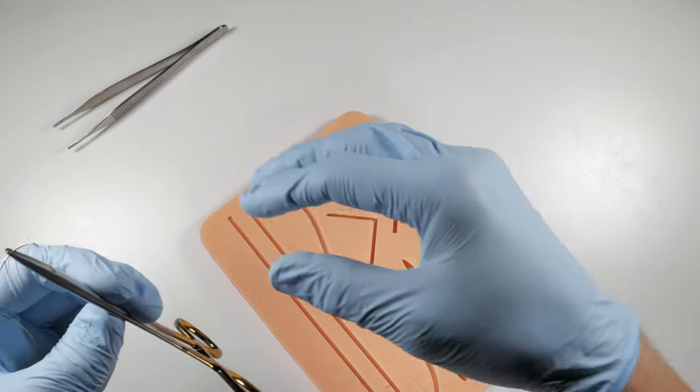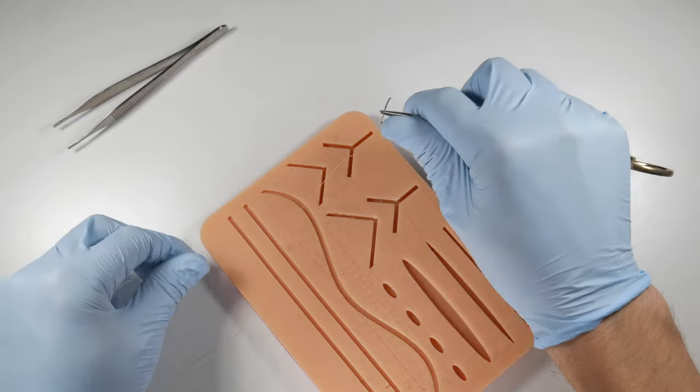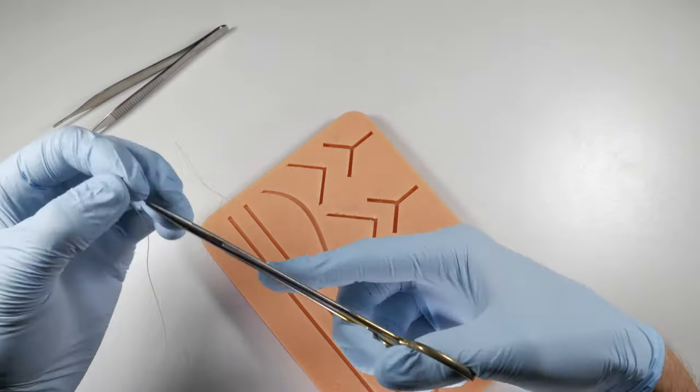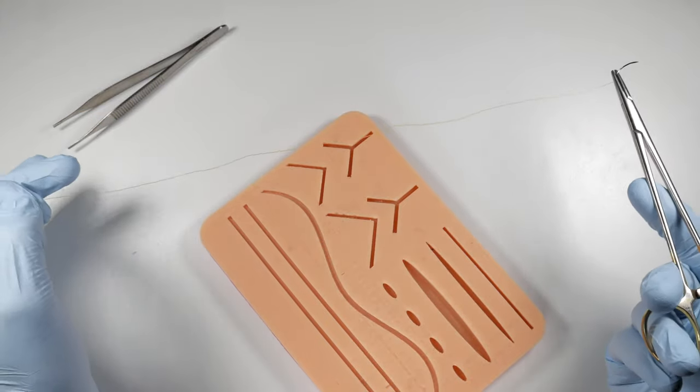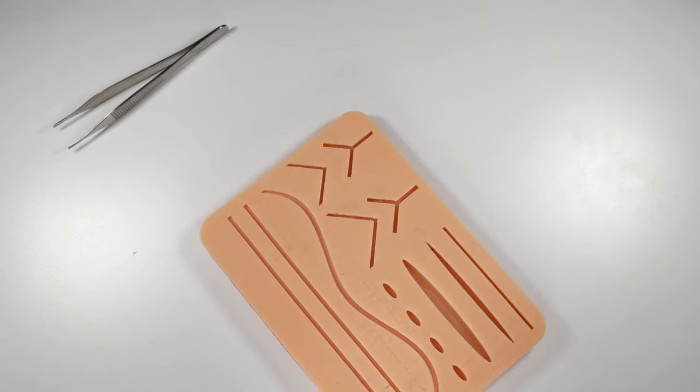Deeper sutures will absorb better. So if you're using a gut suture, you will find that if you place it deeper in the tissue or take a deeper path of insertion when you go through the tissues, you're going to get into some different tissue layers that are going to handle these sutures better to absorb them in a quicker amount of time.